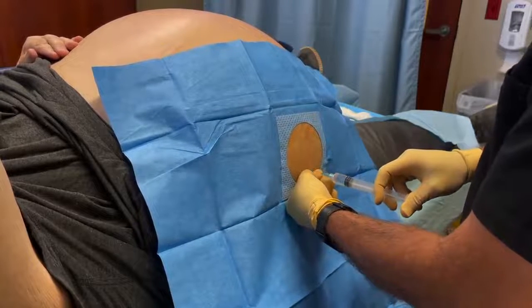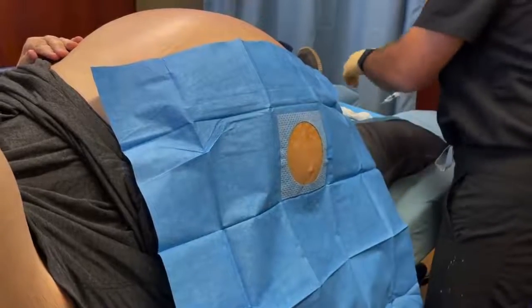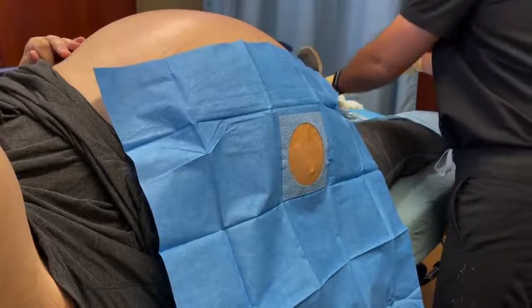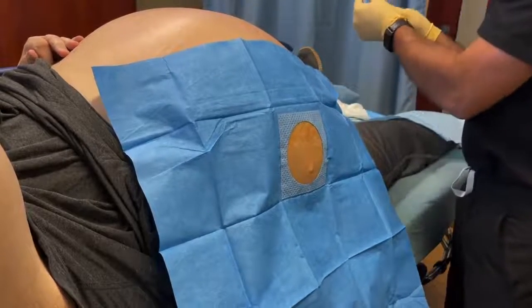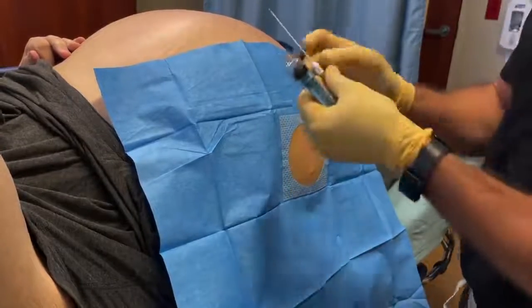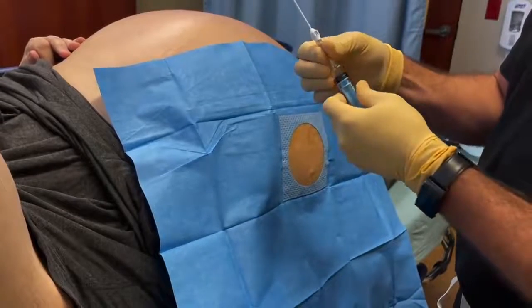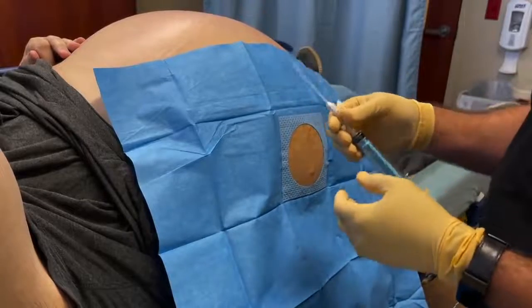So the good news is, you know what I'm doing, so I don't have to explain everything, but I will for the purpose of the video. So this is the main thing. It has the metal and it's covered by a plastic catheter. Some of them are actually longer than this. This is kind of a short one, but it'll work just fine.